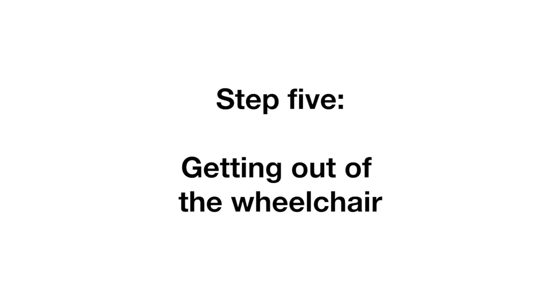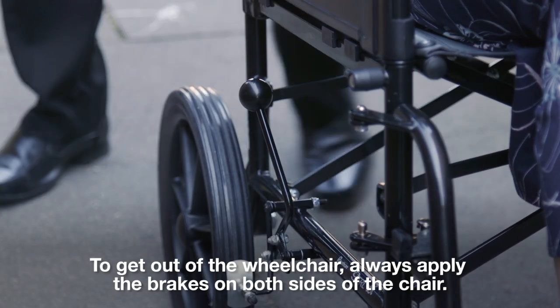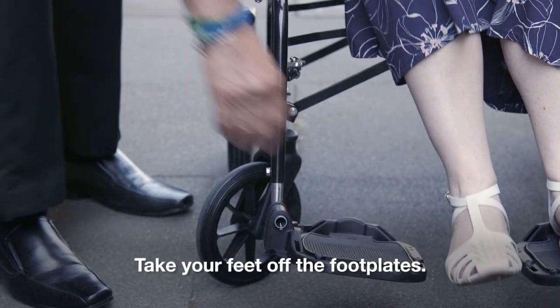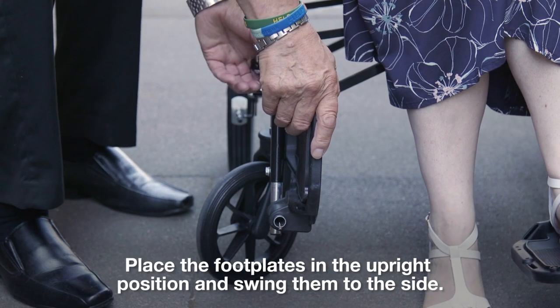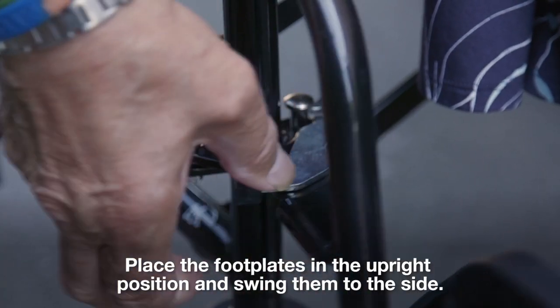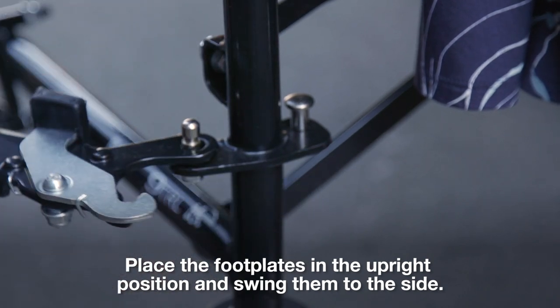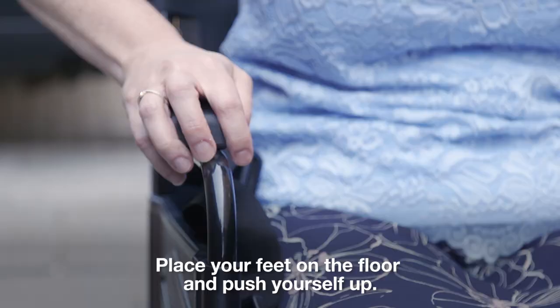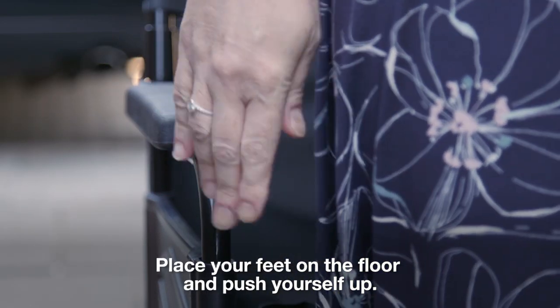Step 5: Getting out of the wheelchair. To get out of the wheelchair, always apply the brakes on both sides of the chair. Take your feet off the footplates, place the footplates in the upright position and swing them to the side. Place your hands on the armrests to support yourself. Place your feet on the floor and push yourself up.